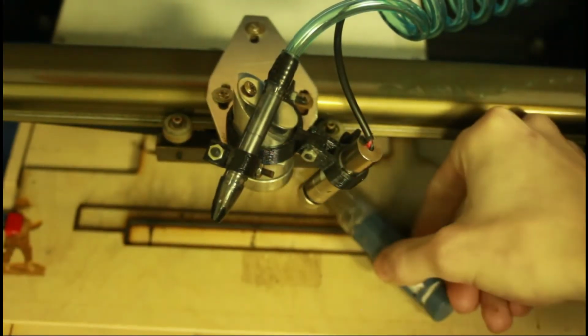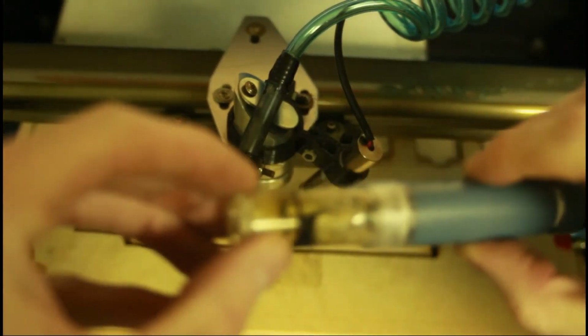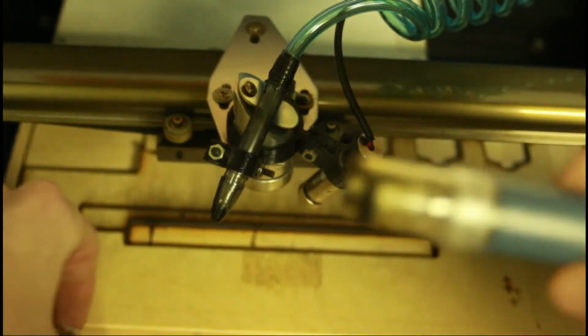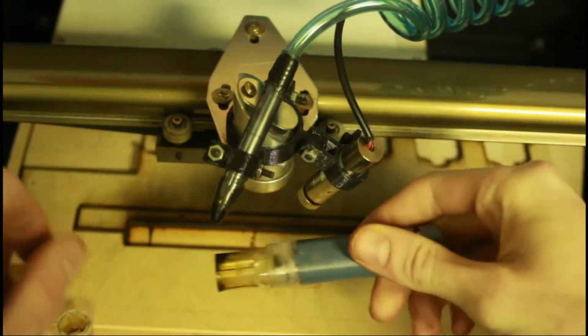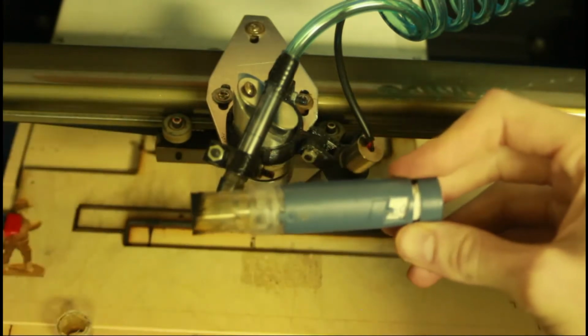And there you have it. Now we can just sort of take this off like that. And now we have the pen cut at just the right size for this project.